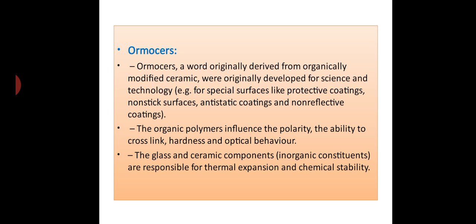Ormocer: the word is derived from organically modified ceramic, originally developed for science and technology. The organic polymers influence the polarity, the ability to cross-link, hardness, and optical behavior. The glass ceramic components are responsible for thermal expansion and chemical stability.